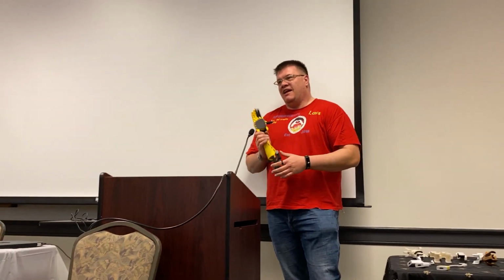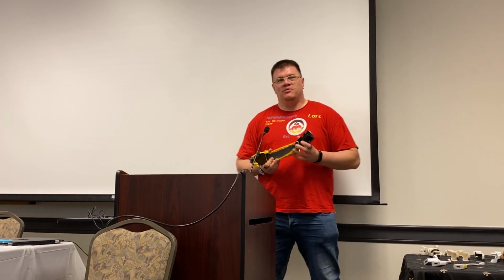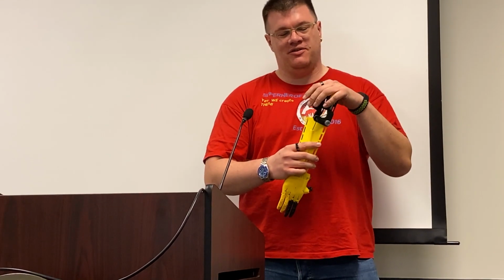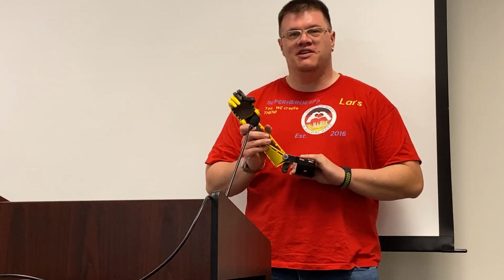So, for example, I did some modifications with the arm, and it is done by a program that we have in e-NABLE, but I cannot get the parts in it, so I take the long way around. I just use the program that we have to scale them up, and then I will use my modifications from the Inventor and I will sketch them over that so that I can just use the whole modification.